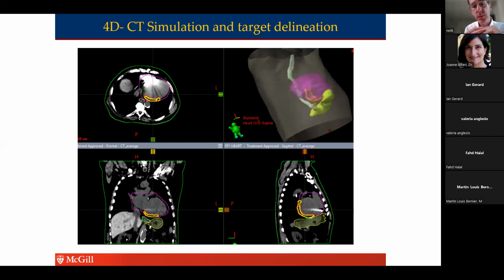What you can also see on this image is that we're not just contouring out the target within the scar that we want to hit with the X-rays. We need to identify, contour out the organs at risk. And in this case, what's critical for us is the rest of the heart itself, but we've also got the esophagus nestled nearby there. And we've got just below the heart, below the diaphragm, the stomach. So these are highly radiosensitive structures, in fact. And I admit I was biting my nails. I still bite my nails when we bring these patients to our department.